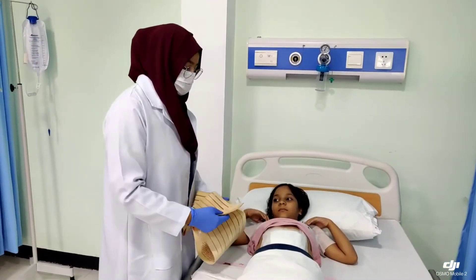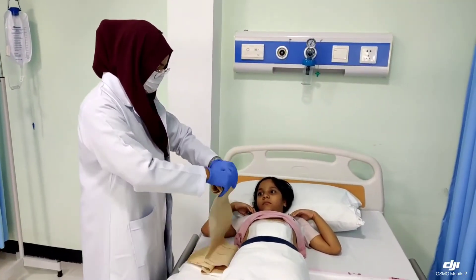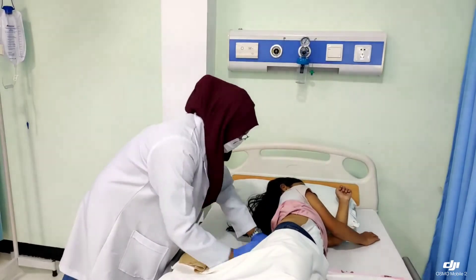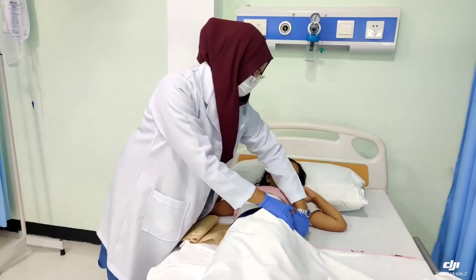In case the patient is very heavy or you cannot lift the patient, then you should roll it towards you a little bit. Can you roll from the side? And place it. Careful. Roll the patient back. Now you can take it from the other side.